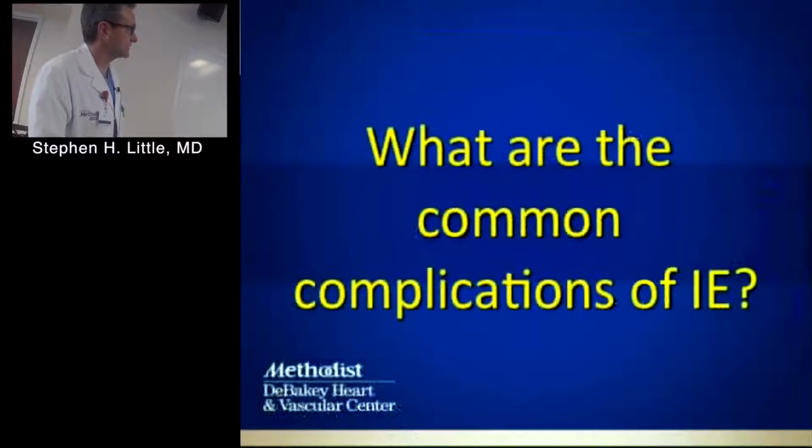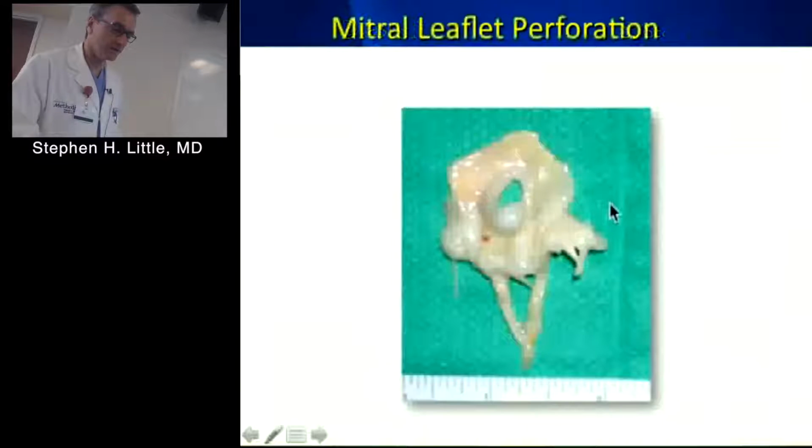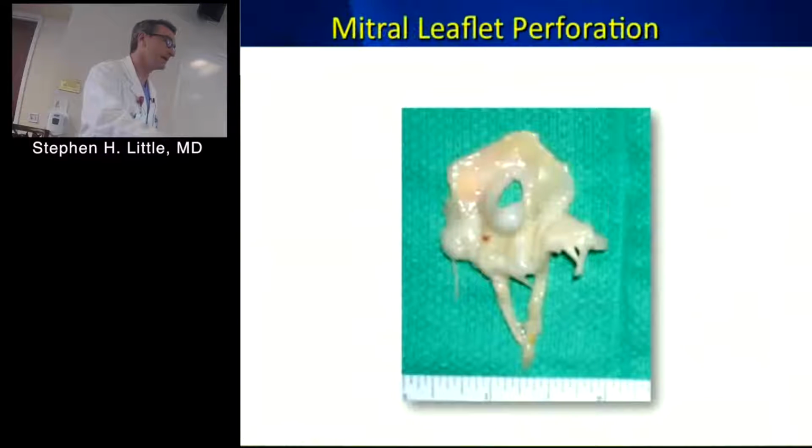This is an obvious one here. Some thickening here. You see this destruction. I've actually got movies, I think, that show this a little better. This is one of my patients. So a leaflet perforation. We've had many cases of that.